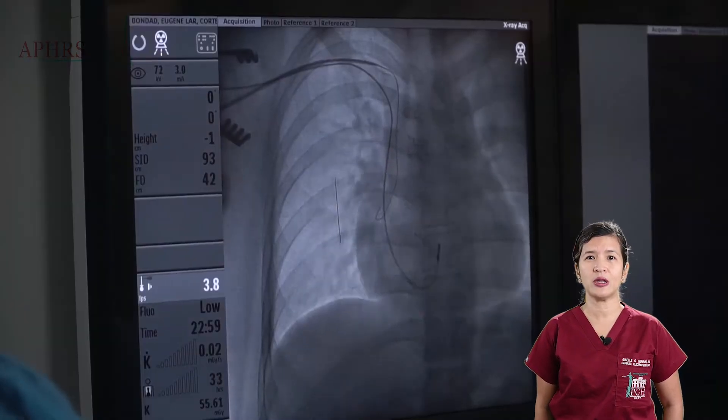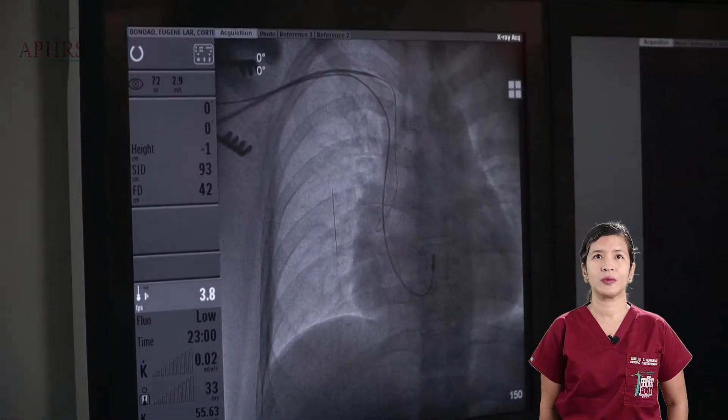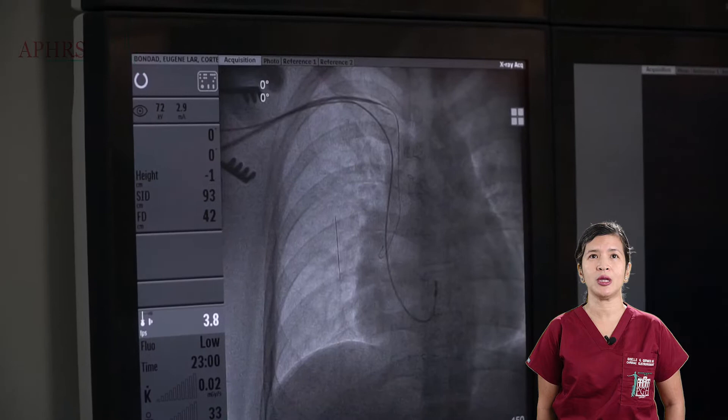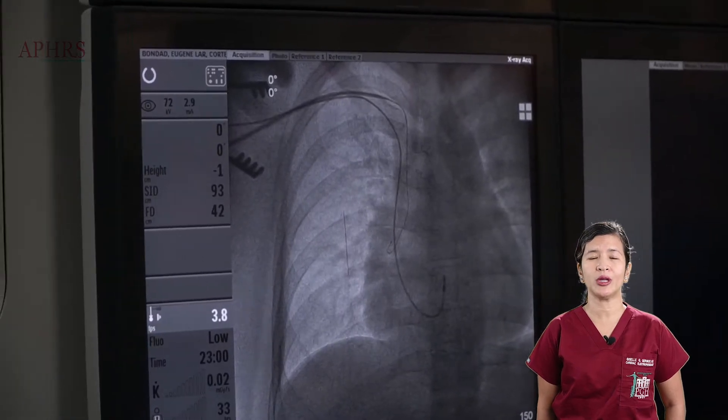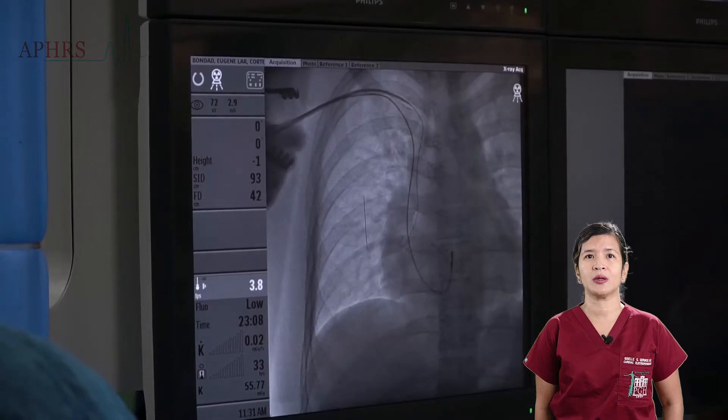The peel-away sheath is inserted using the second guide wire, once again under fluoroscopy, to ensure that no inadvertent snagging of vein or heart wall muscle occurs.